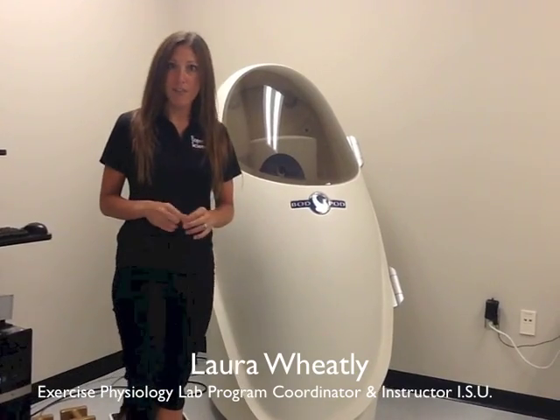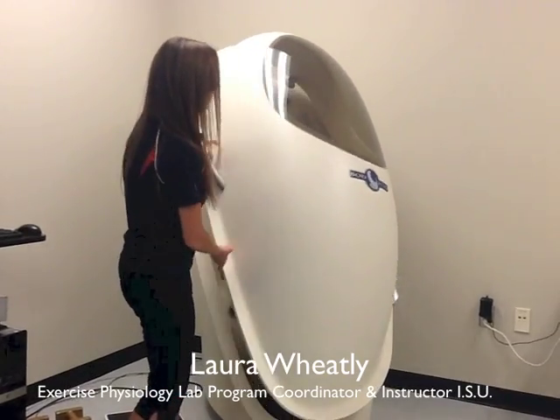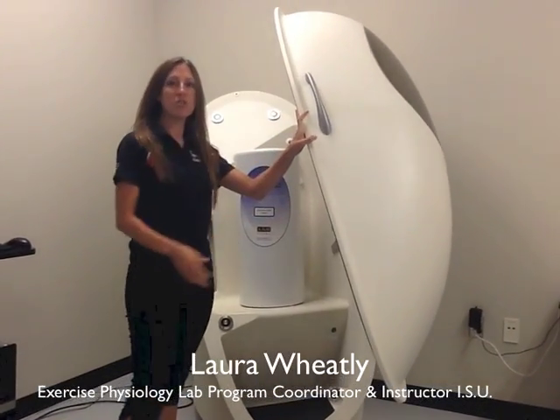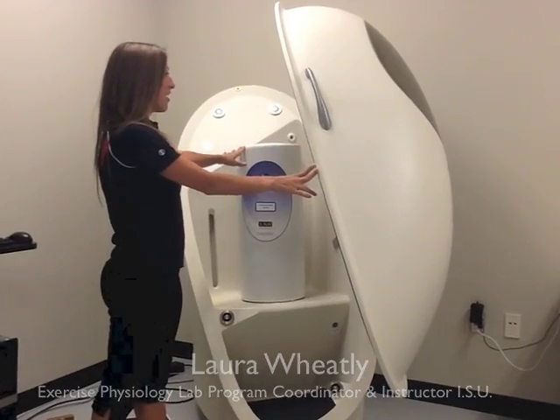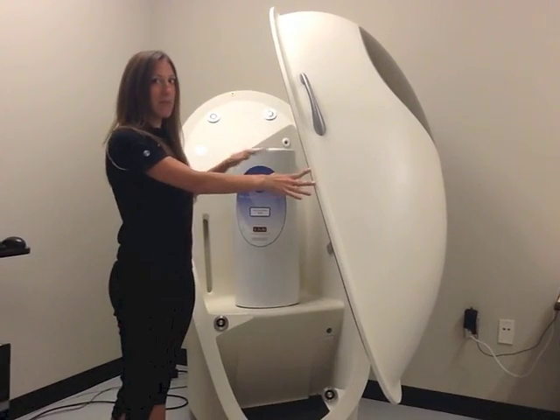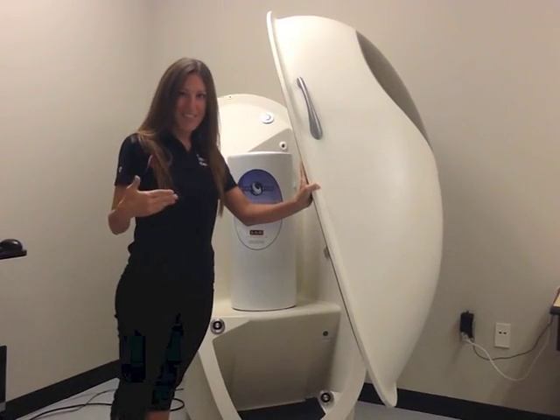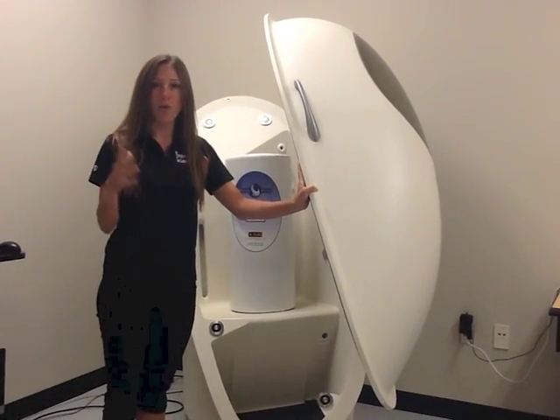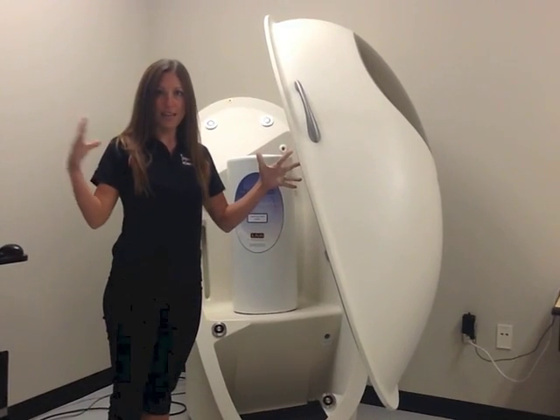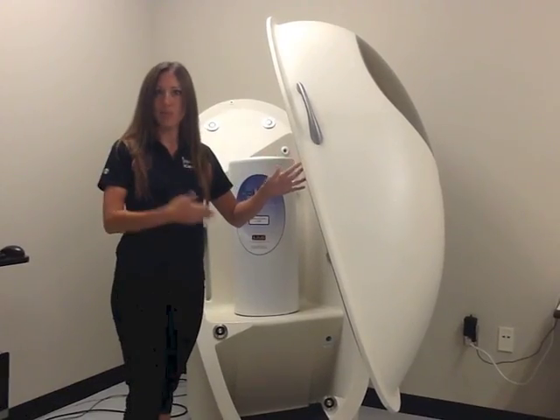This is our Bod Pod. It measures body composition by air displacement and plethysmography. We're going to open the Bod Pod up and Susan and Ray are going to sit inside. Essentially they're going to be displacing the air in this chamber into our back chamber, so we'll be able to measure how much space they're taking up. If they have more muscle mass, they are going to take up less space. If they have more fat mass, they will take up more space and therefore displace more air.